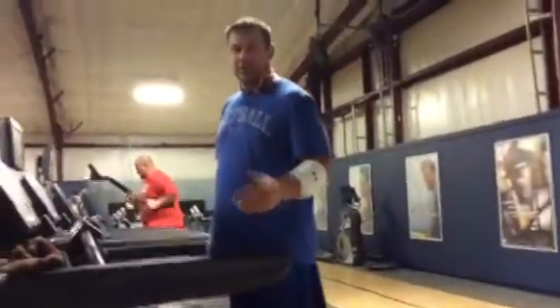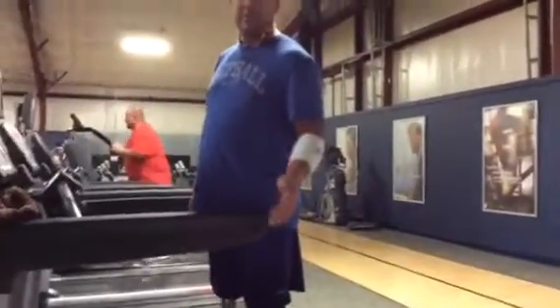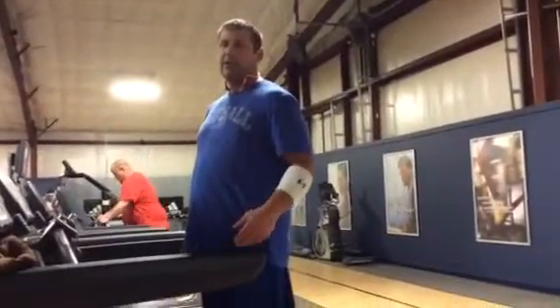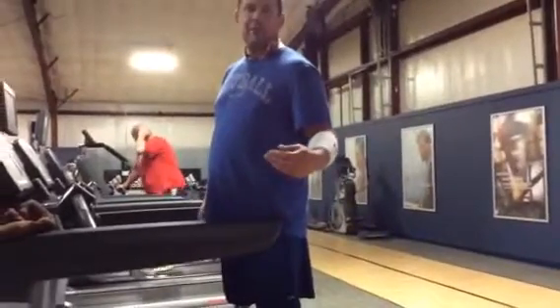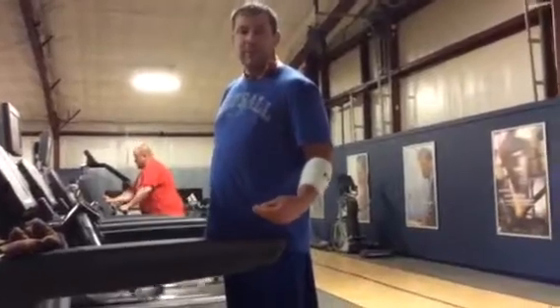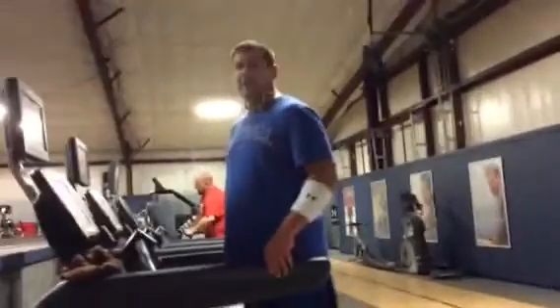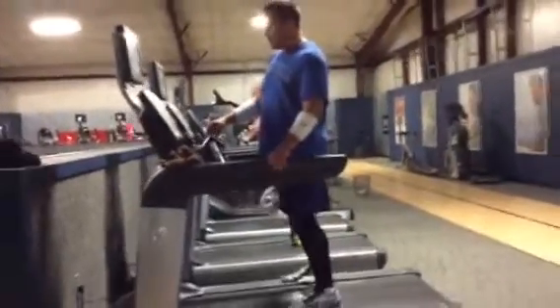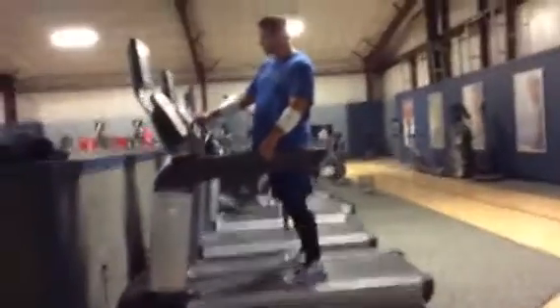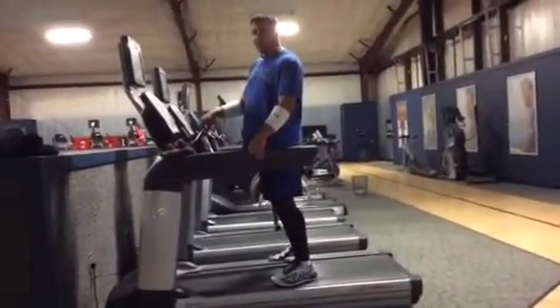But the advantage is you can use it to play other sports, like softball or baseball or volleyball or court sports. Things where you can shift from side to side and run short distances. The circumduct method is more of a jog, allowing you to go for longer distances. But if you want to do things in short bursts and run in the backyard and things like that, running with the bent knee is not impossible to learn. We're going to start out at a walk and then build up to a jog. And then hopefully we can go into a sprint.